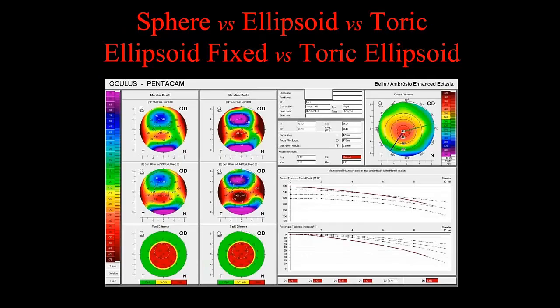So this is just a quick comparison. The reason we use a best fit sphere is because, one, it's the easiest to interpret, the most intuitive, and as you can see, it actually makes visual inspection the easiest. So this is a series of patients with markedly advanced keratoconus. So these aren't patients that have just mild disease. You can see a big prominent anterior ectasia, prominent posterior ectasia, a markedly thin cornea, and a grossly abnormal pachymetric progression.